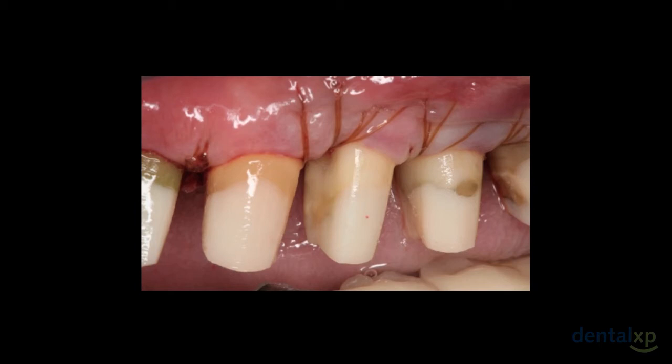This helps for a significant amount of decrease in discomfort and much better healing since we have primary closure. The arrow points to the location of where I have placed my suture to attach the periosteum. Because I did do osseous surgery, my periosteum is not present for about 4 to 5 millimeters apical to the gingival collar or the bone. So the suture must enter the periosteum up in this 5 to 6 millimeter area to grab the periosteum to tack the flap in place. So what you are looking at is a flap that literally can't move.